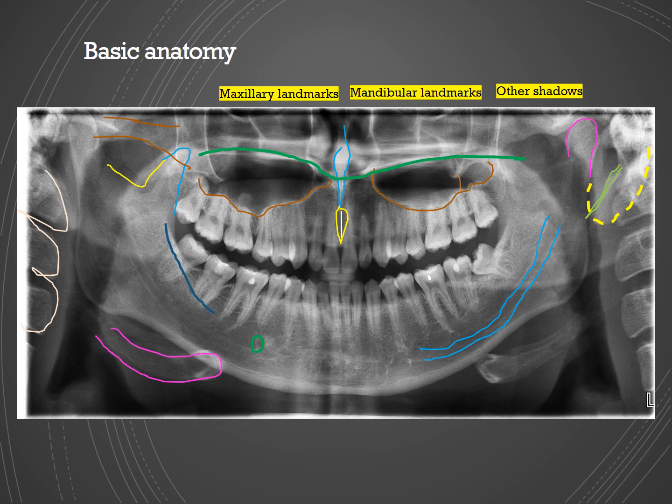So most of the landmarks that we just covered and I was talking about are here, both maxillary and mandibular. You need to keep looking at all panoramic radiographs to understand that all of these anatomical landmarks would be present in any panoramic radiograph, and it's important that you delineate the difference between the anatomical landmark and a pathology or a finding.